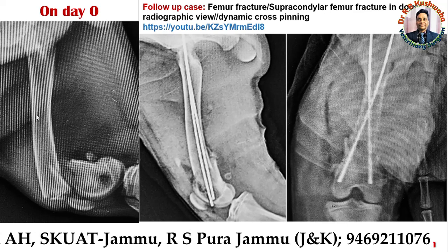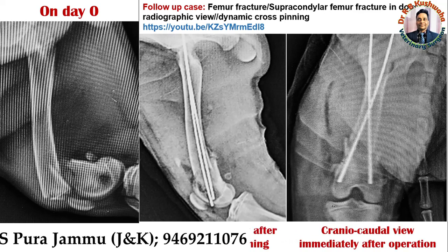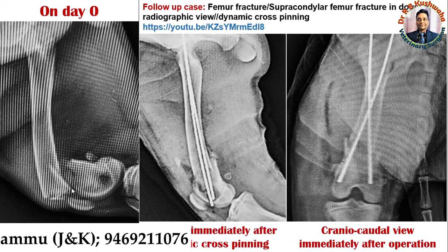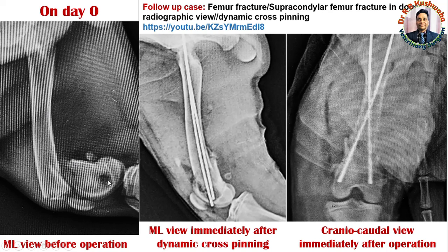This is the radiograph on day 0. This is the mediolateral view of the fractured femur bone before operation. You could see this is the long proximal fracture fragment and this is the very short distal fracture fragment, just above the condyle — that is why it is called the supracondylar fracture.